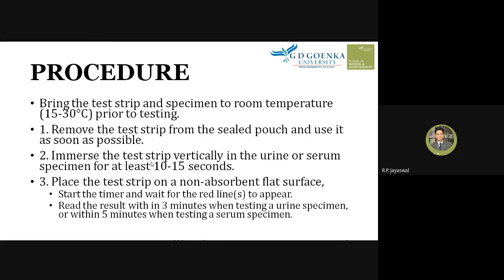When you have done the exposure of the test to the specimen, then after that you can place the test strip on a non-absorbent flat surface. So put it somewhere, maybe on a plate or somewhere else where the surface is non-absorbent and flat. Okay, and now start the timer. Wait for the red line to appear.